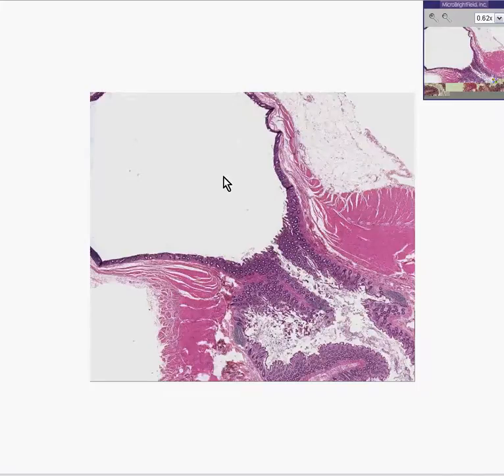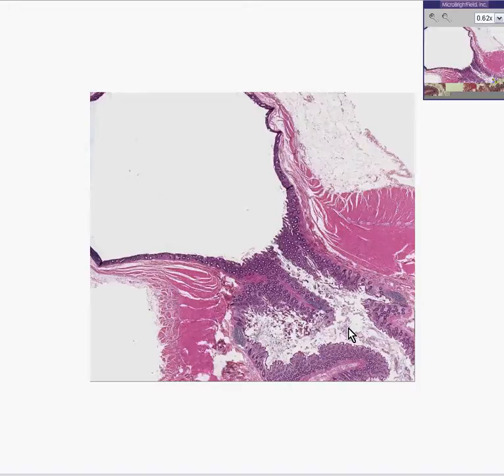This is a classical diverticulum of the colon microscopically. They are very common in the Western world, and very common in old age. Almost all of us older people probably have them.